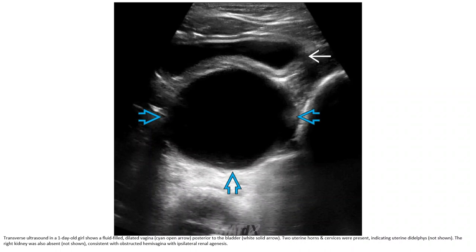Transverse ultrasound in a one-day-old showing a fluid-filled dilated vaginal pouch, two uterine horns and cervix were present, indicating a uterine anomaly. The right kidney was also absent, consistent with ipsilateral renal agenesis — findings consistent with OHVIRA syndrome with ipsilateral renal agenesis.